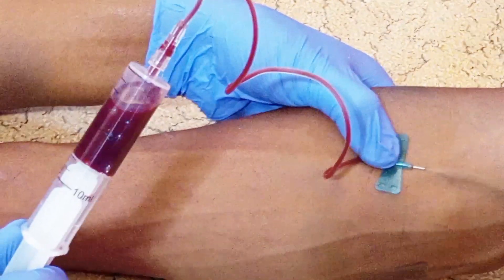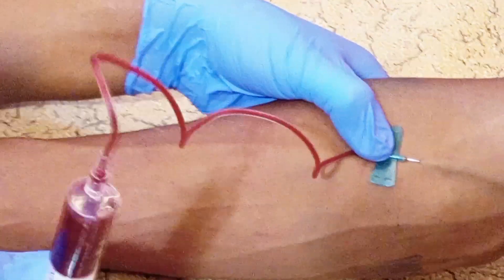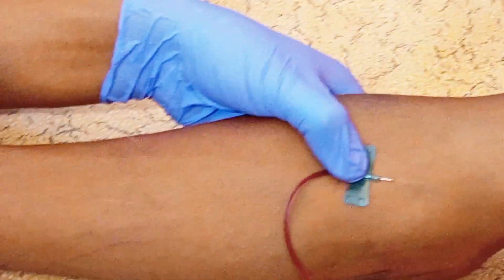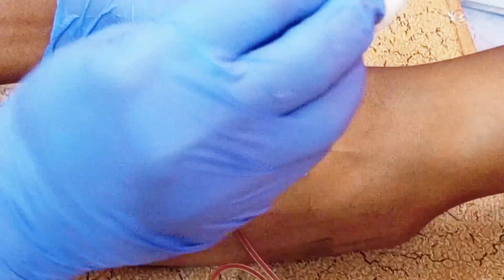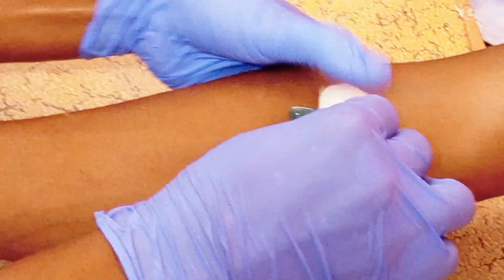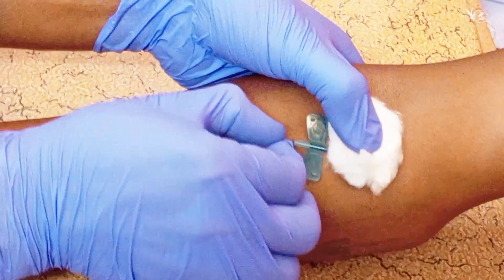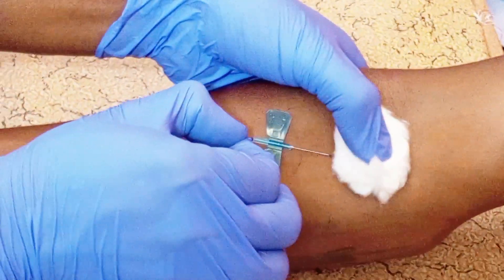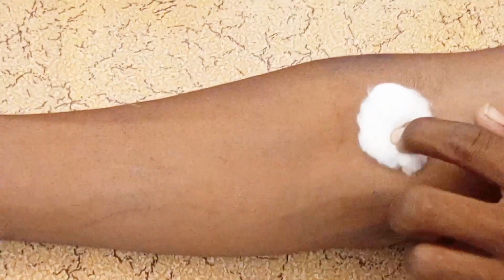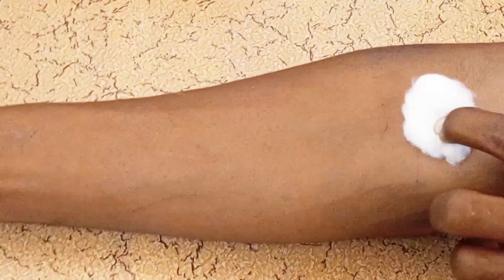That is how we take blood using the butterfly method. When you are done, first release the tourniquet, then get a cotton wool and apply it on the area. That is how we take blood.